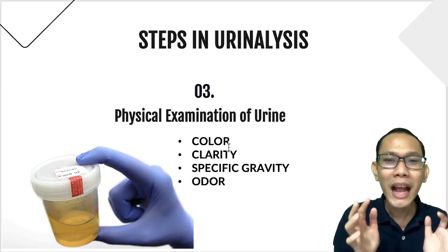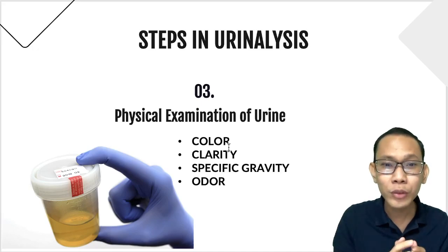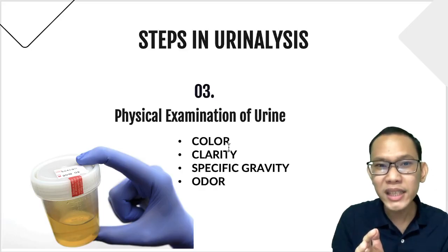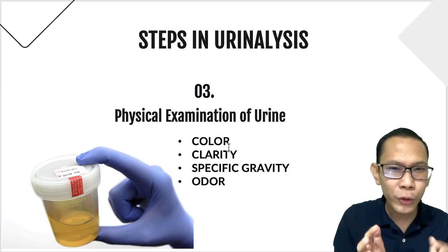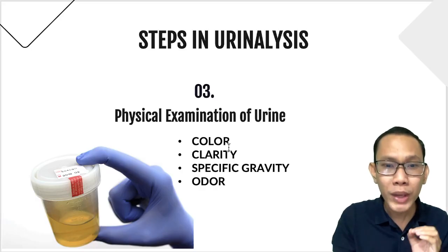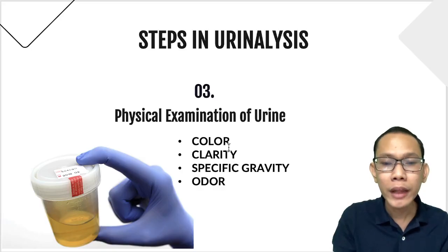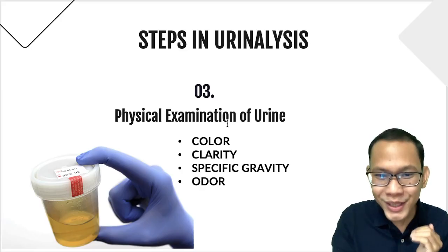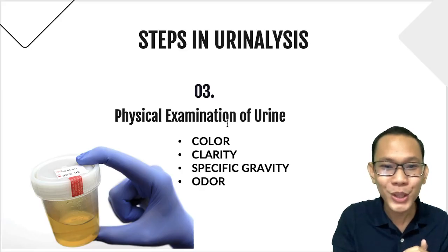We would define it as a pale yellow, light yellow, or dark yellow as long as you are of the same spectrum. But then again, we have to make sure that we have this kind of parameter for us to be able to come up with almost the same observation. Kasi nga, physical exam, it's really based on your senses, based on your observation.